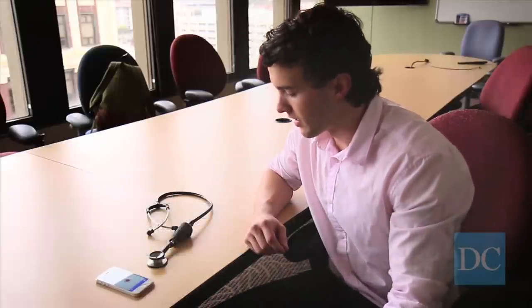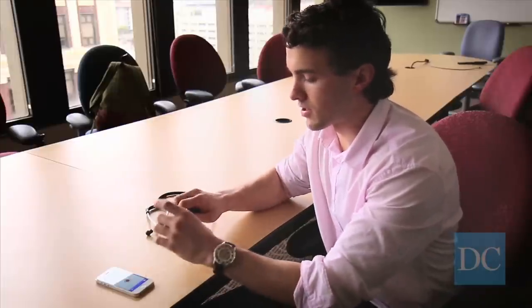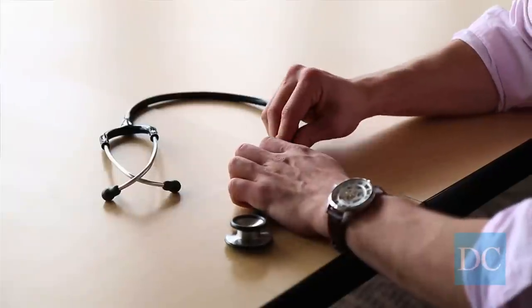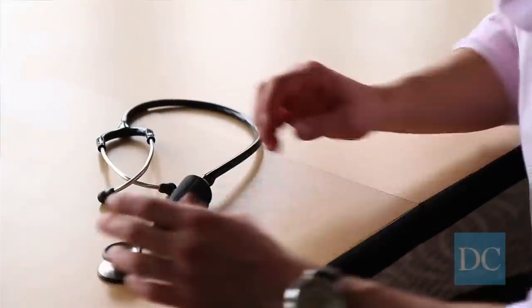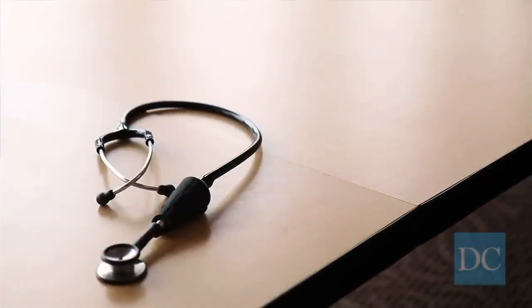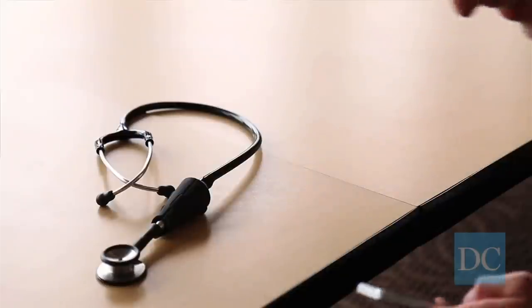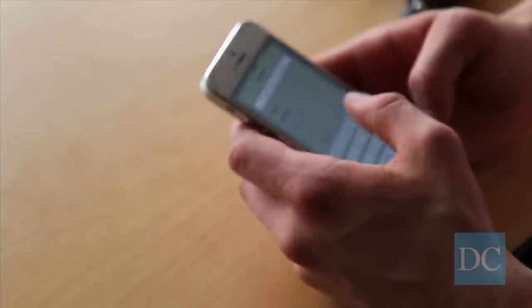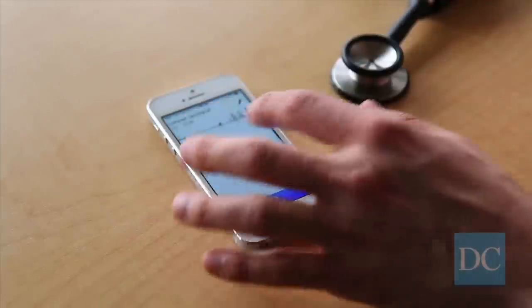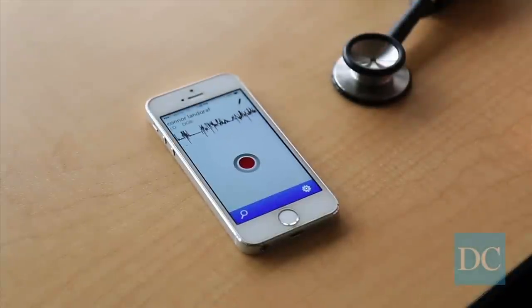This is the Echo stethoscope attachment. You can see the hardware piece right here and the smartphone application running on the cell phone. The hardware device contains a number of microphones, Bluetooth transmitters, and some amplifying circuitry. It picks up all the sounds from the stethoscope head — a standard analog stethoscope that all physicians have in their toolkit — and transmits them to the smartphone via Bluetooth. You can see the waveform, which in this situation would be my heart sound.